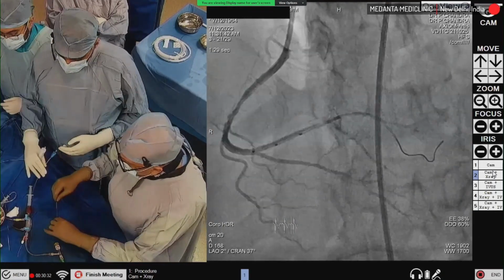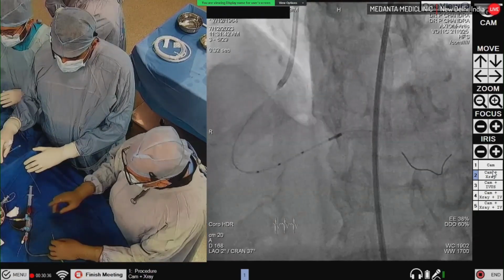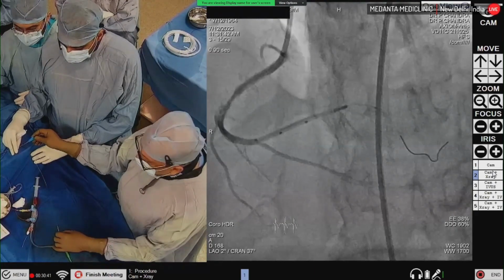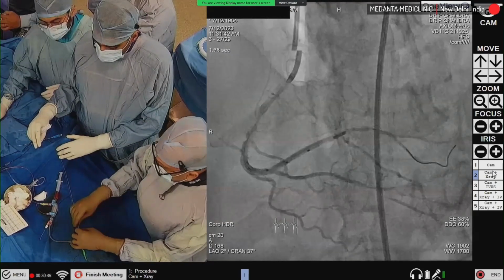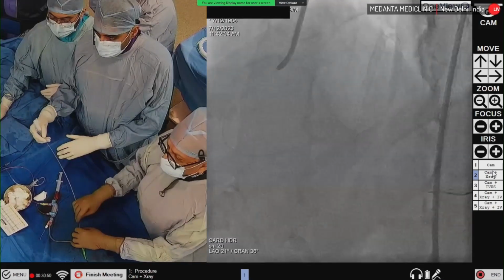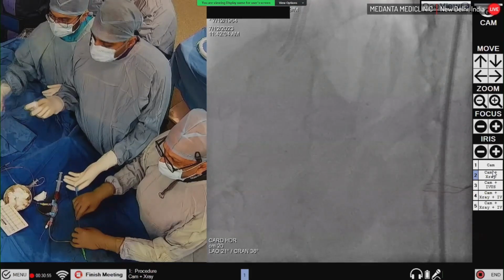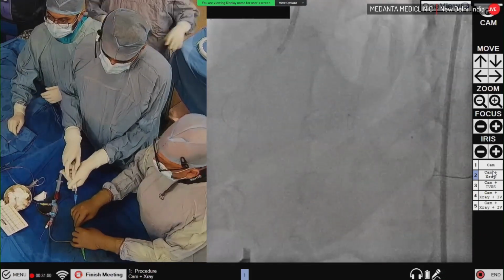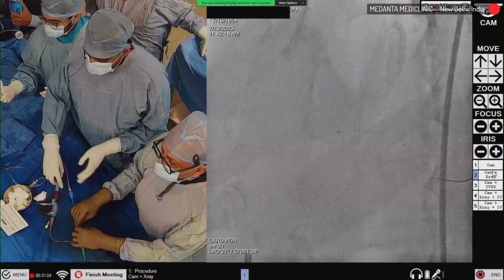Okay. So this is a 2.5 millimeter, and this is a 2.25, 25, and this is the solution which comes from Medalliance, and now it is a J&J stent, J&J balloon. So there's a drug-eluting balloon which has slightly different release kinetics because the drug is in some kind of globules, what they have made. And the balloon is wrapped in a proper way.